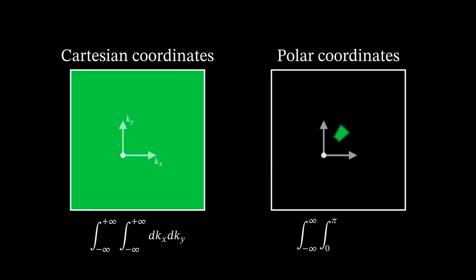Setting now the integration limits of dr from -infinity to infinity and the integration limits of d phi from 0 to pi, we can move around the area element in this regime. But as these integration boundaries allow also negative radii, the r d phi length must get adjusted to modulus r times d phi to account for negative radii values of r. Now we can also sample the K-space here.